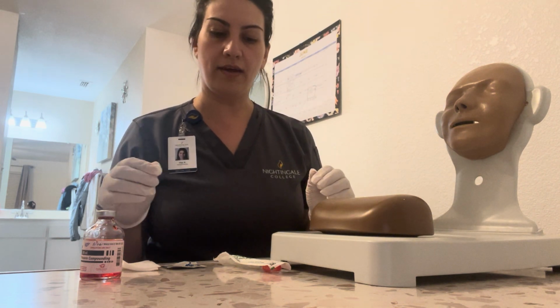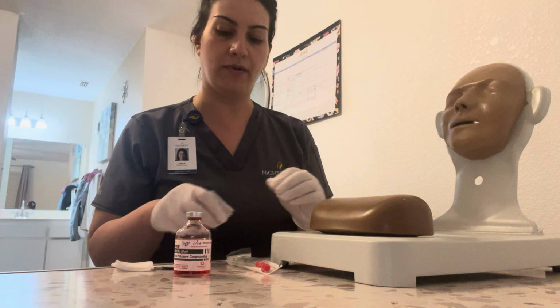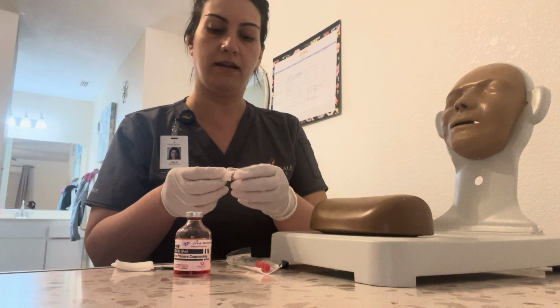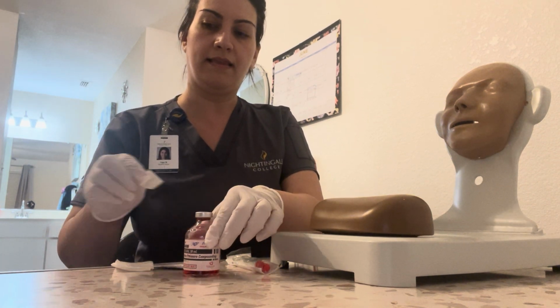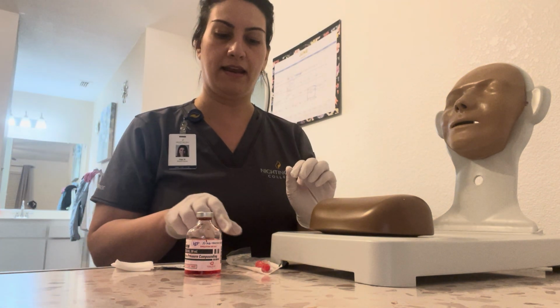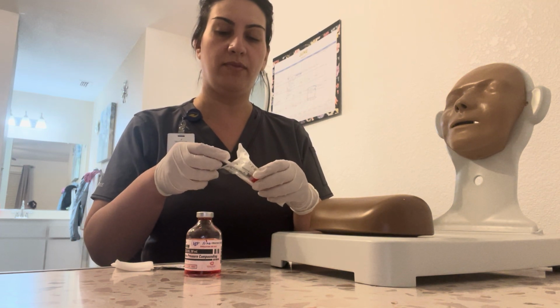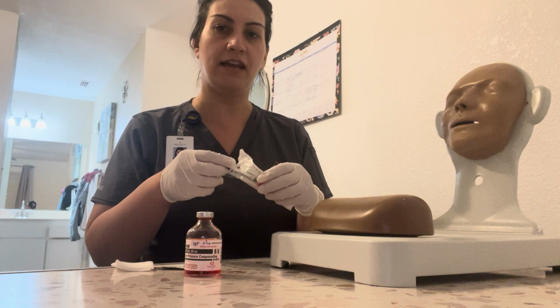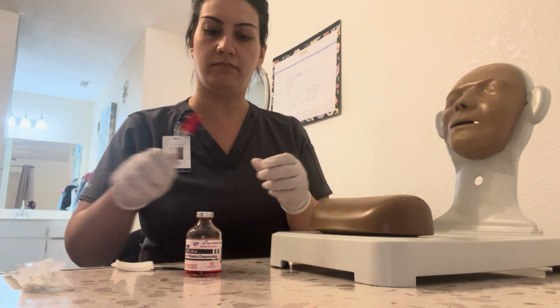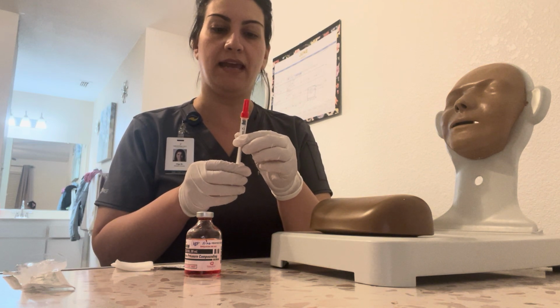Next, we want to go ahead and get the medication vial ready here. We're going to clean up the top. We're going to discard that. We're going to clean it up, let that air dry, and we're going to get the medication ready here. So I'm going to take this out, and we're going to be using a 29 to 30 gauge half-inch 1 milliliter syringe. We want to hold this as a pencil, needle pointing up and cap still on.